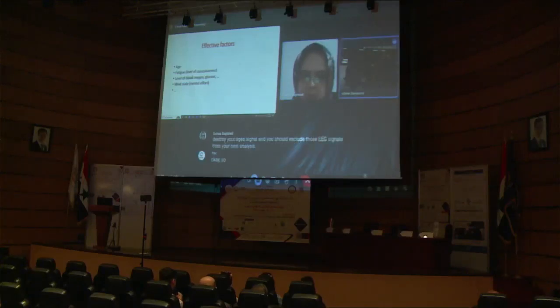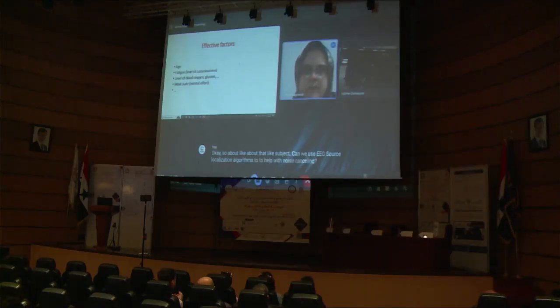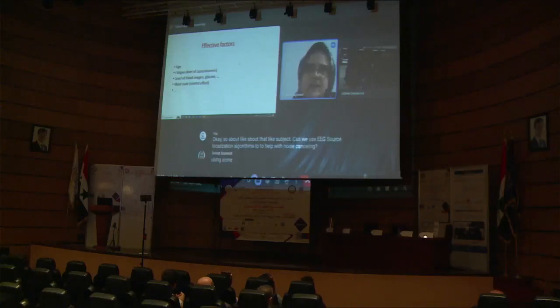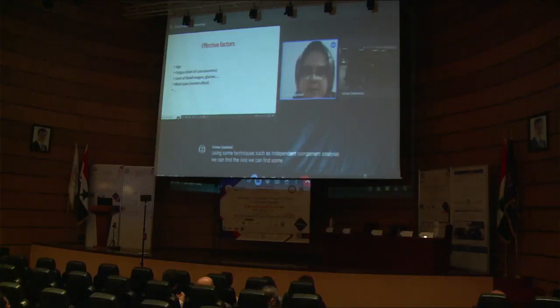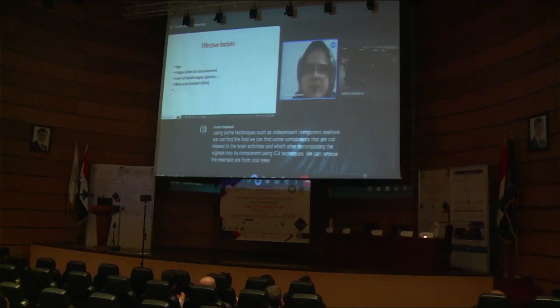Okay, so about that subject, can we use EEG source localization algorithms to help with noise cancelling? Using some techniques such as independent component analysis, we can find some components that are not related to the brain activities. After decomposing the signals into its components using ICA techniques, we can remove the components that, for example, are from your eyes or maybe your heart or some other regions that are not related to your brain activities, and by using such techniques, we can remove the noise components or artifacts. I will describe ICA in this workshop.